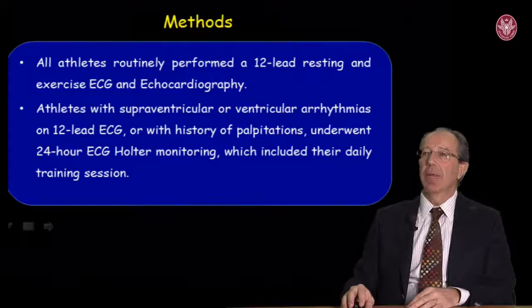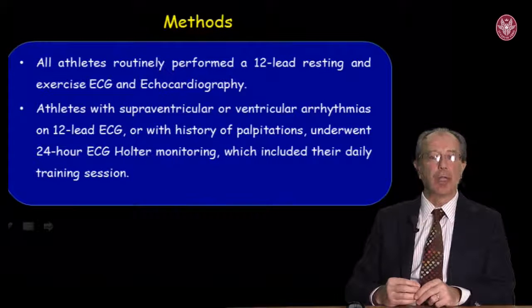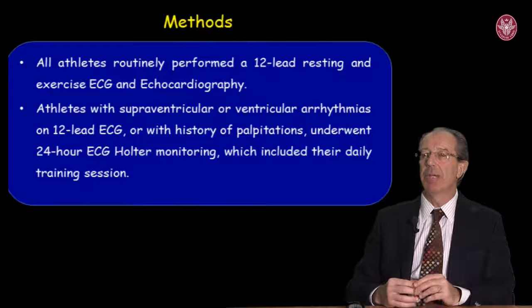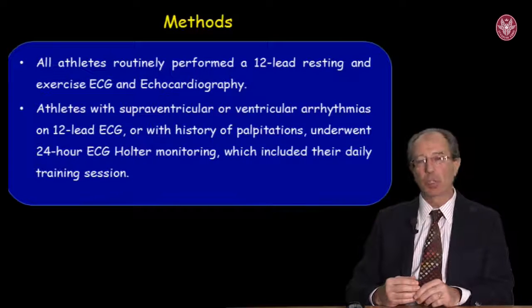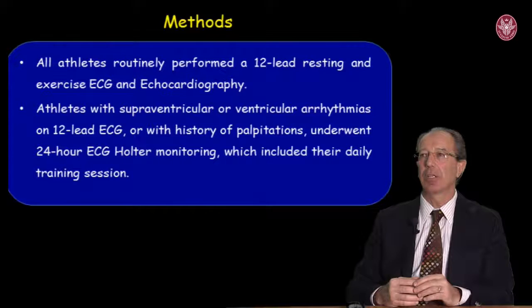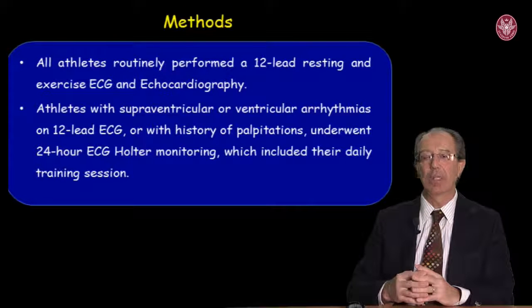What we did, athletes were routinely evaluated by 12 lead ECG, exercise electrocardiogram, and imaging testing to confirm or exclude the presence of structural cardiovascular disease. And all the athletes with any kind of supraventricular or ventricular arrhythmias, either on 12 lead ECG or on exercise testing, all underwent 24-hour Holter monitoring, which included a daily training session.